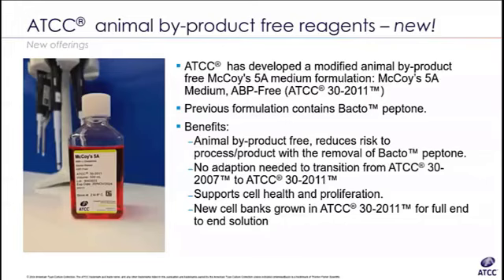Great. And I think you might have mentioned this in your presentation, but can you grow the new reformulated McCoy's cell lines in the old McCoy's formulation? Yep. So the cell lines are compatible with both formulations. The data indicates that you don't need a transition period, so you can switch between the two formulations as desired.